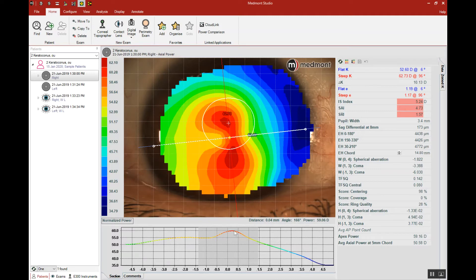That's seen on the graph down below — steepest in the center, flattest toward the periphery. The difference is, for this diseased eye, there's a much higher rate of flattening and an asymmetric rate of flattening between the various directions. We notice in the eccentricity value, we have a 1.19 e-value on the flat and a 1.17 eccentricity on the steep — a much higher e-value. This patient would be considered a very elliptical surface.